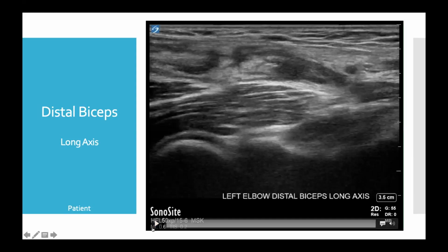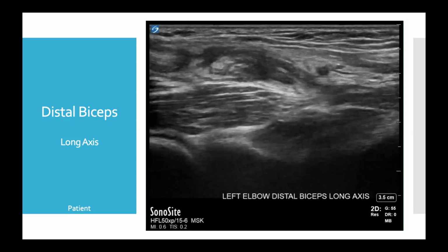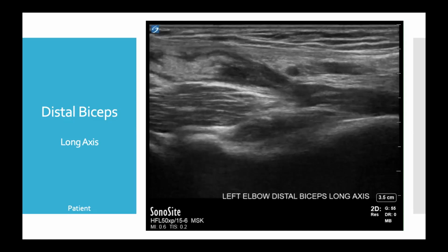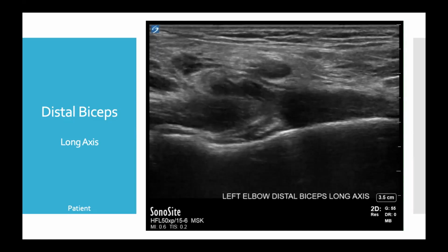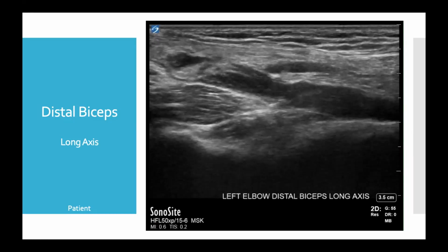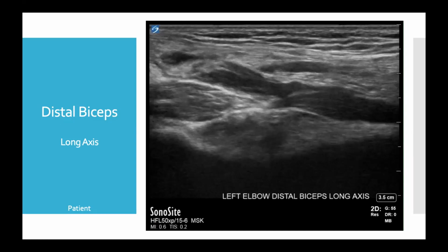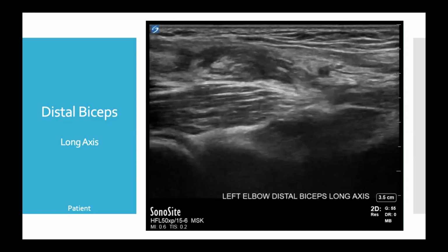So that we just saw was unfortunately not the patient, but a normal example of a distal bicep. And here we have a clip of our patient's distal bicep, and I'll let this run a couple times. So here we can see the radial tuberosity coming into frame where we would expect there to be a clear insertion of the distal biceps tendon.